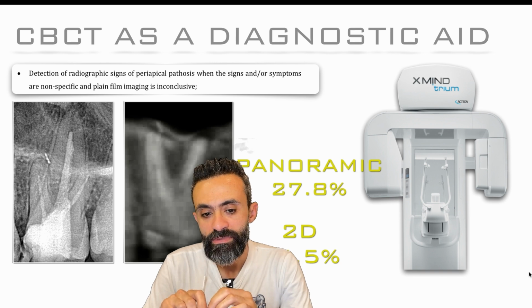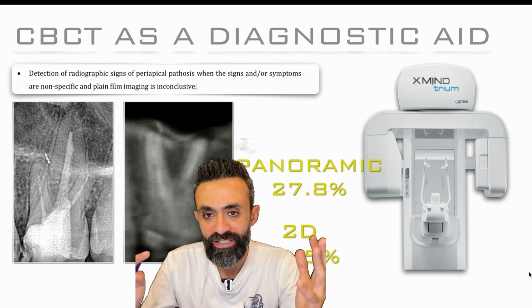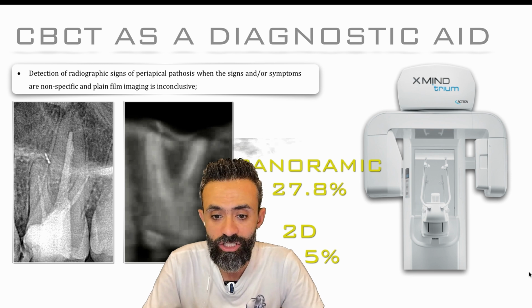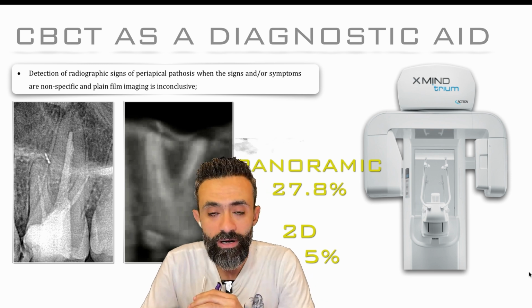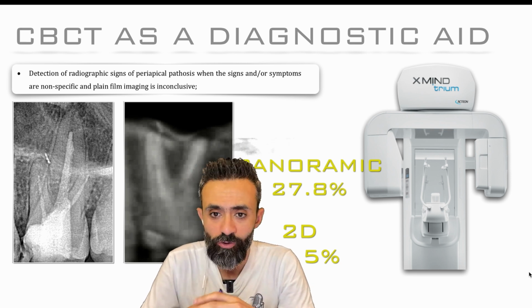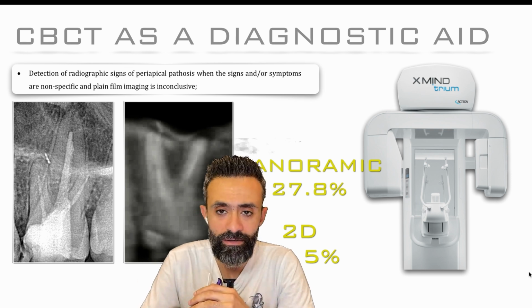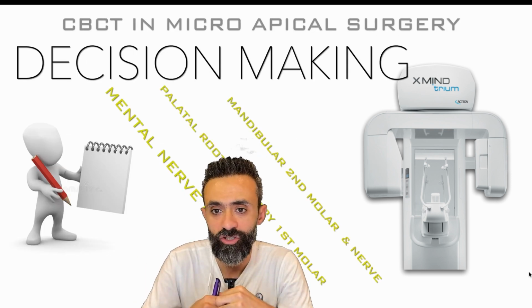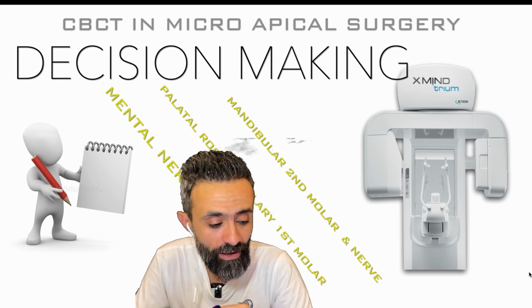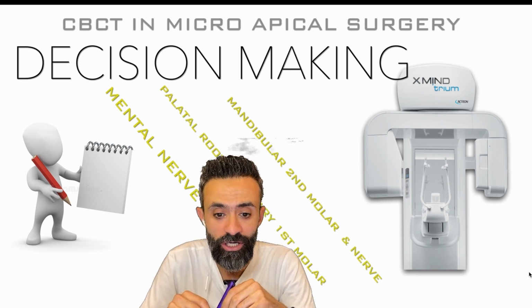Yeah, I think CBCT is for sure an important tool that allows us to evaluate the situation and see the area better. And this was, of course, according to the society's recommendation to take a CBCT before apical microsurgery, because it's not only about the tooth, as you said, but sometimes the involvement of other teeth, the proximity to some vital structures or important areas, danger zones, as we said. So, of course, CBCT gives us a deep insight into the third dimension.